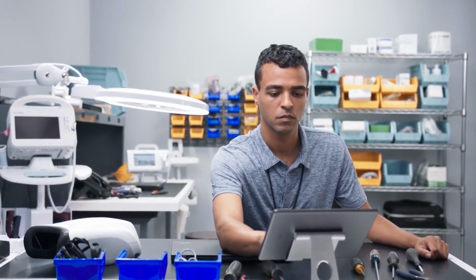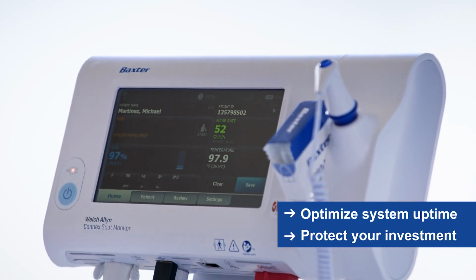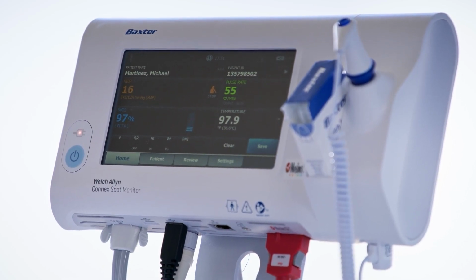This online tool will help you optimize system uptime, protect your investment, and help everyone in your healthcare system focus on what's most important: providing quality patient care.